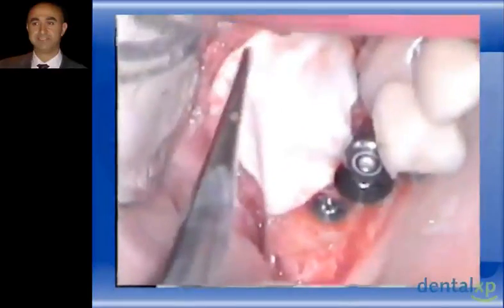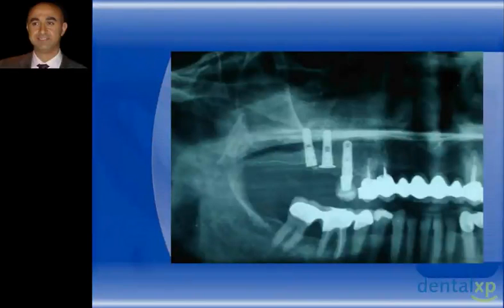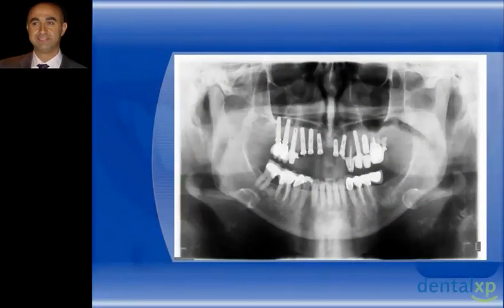This is the same case, and the patient chose afterwards that we remove most of the teeth because they were predominantly affected, and place more implants and connect all the implants together and splint them together to counteract any detrimental lateral forces.